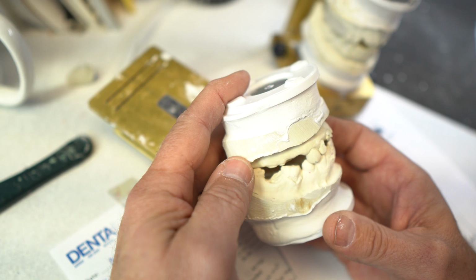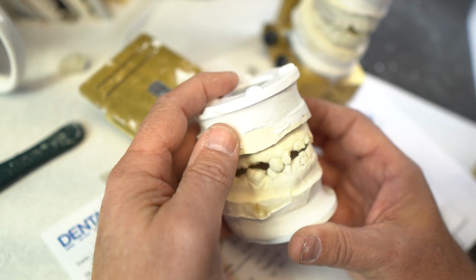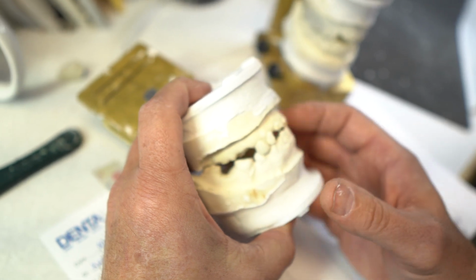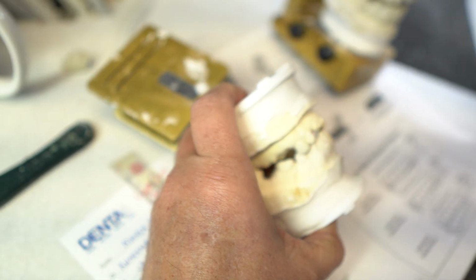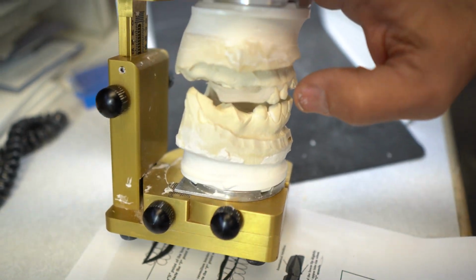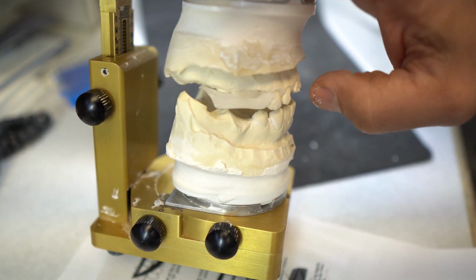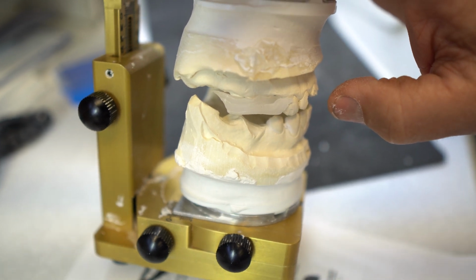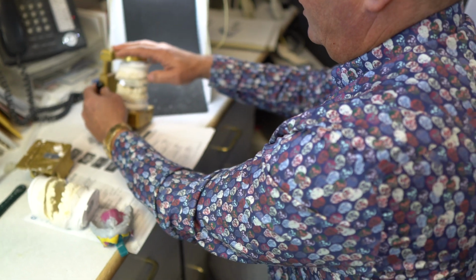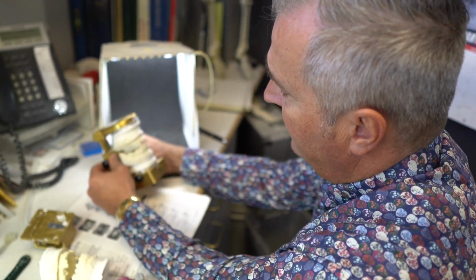So what our suggestion is, and this is what we like to help doctors with this learning curve, is first build a nice level plane of occlusion. Now we're just setting this case up, and do an immediate denture on a case like this first, before implants, before dialing in the bite.